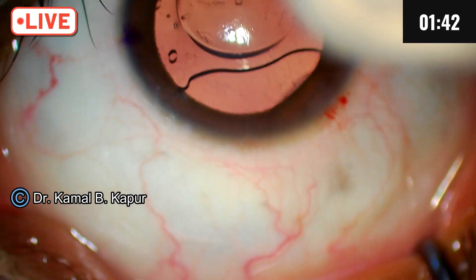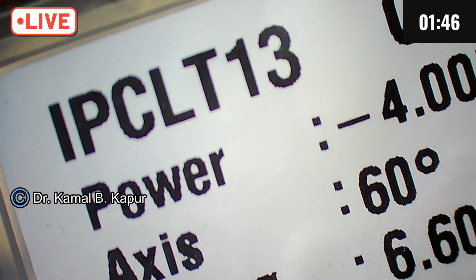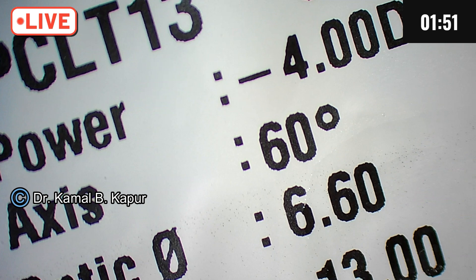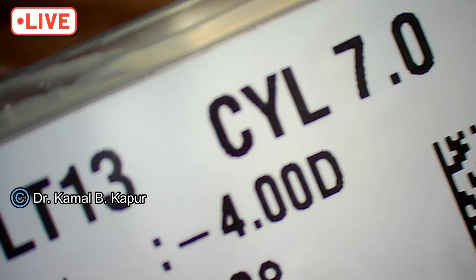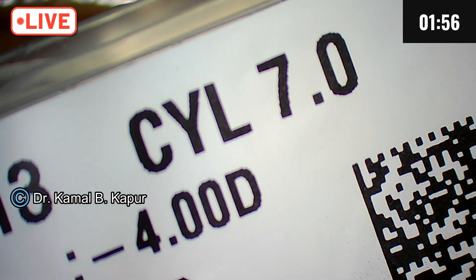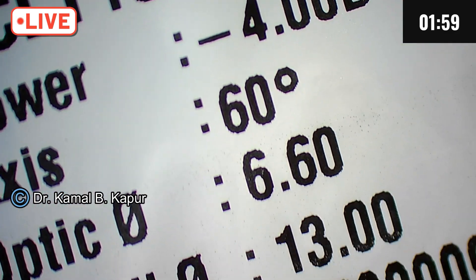This is the IPCL — minus 4 with seven diopters of cylinder at 60 degrees.